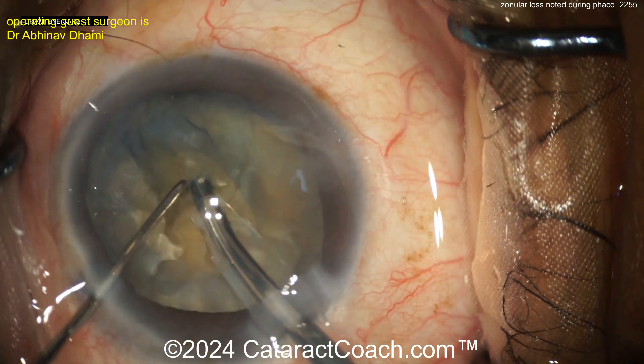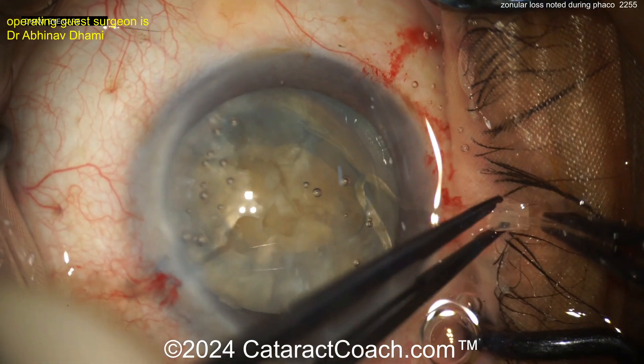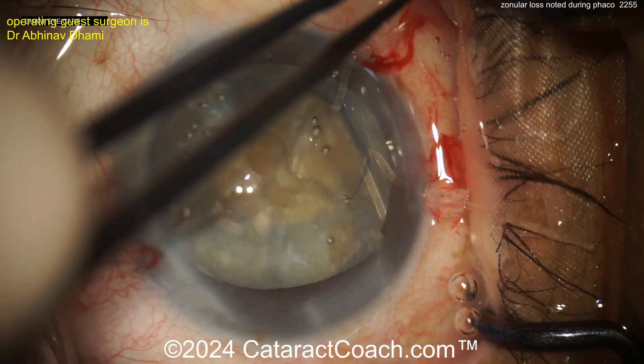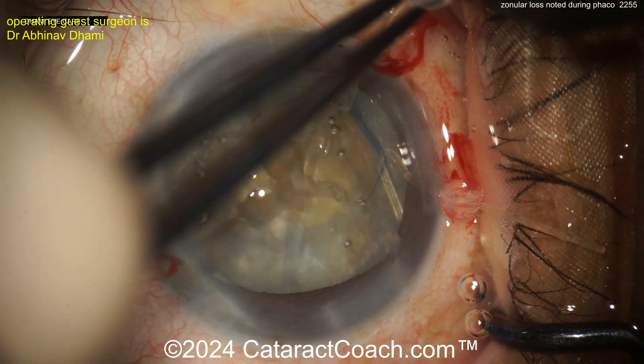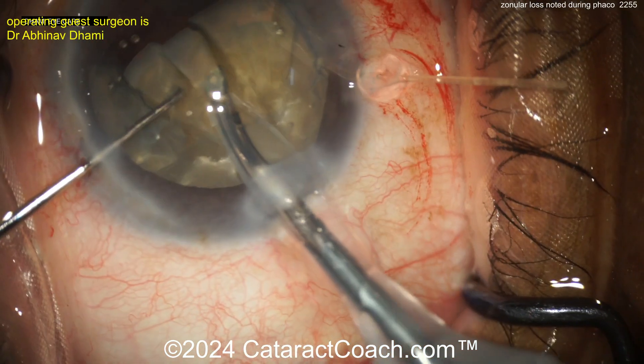So what should you do at this point? You need to stabilize the bag. Time for some capsule hooks. These are actually capsule hooks, not iris hooks — you can see the orientation, the shape of them is a little bit different. Getting in two of these is going to provide some good support in that area. That's a good move.